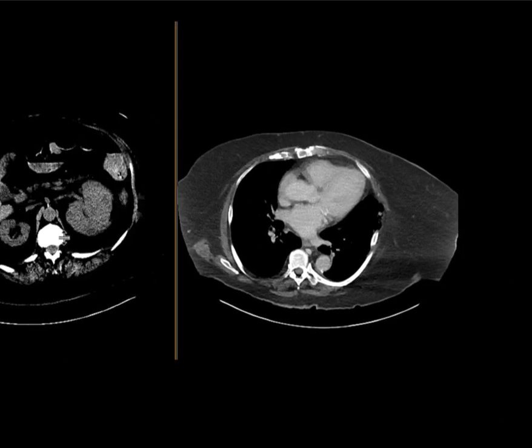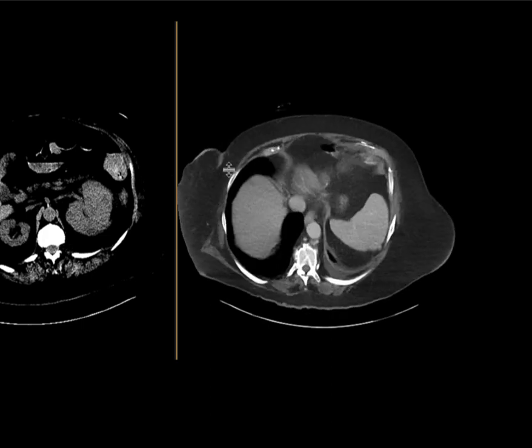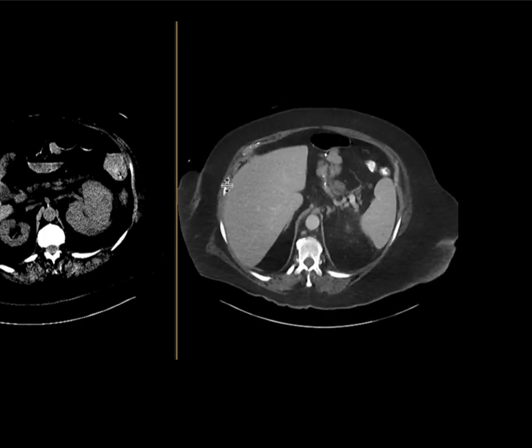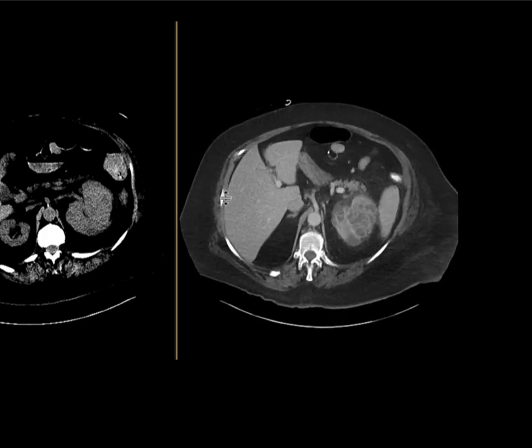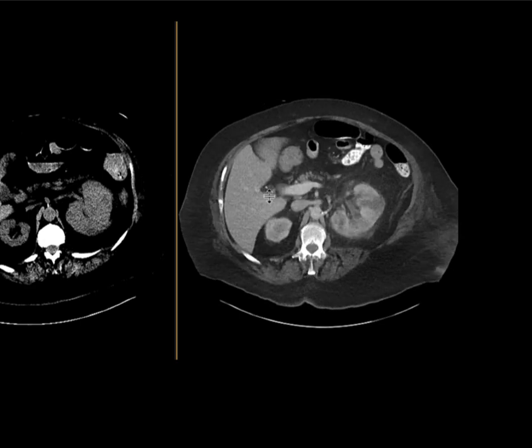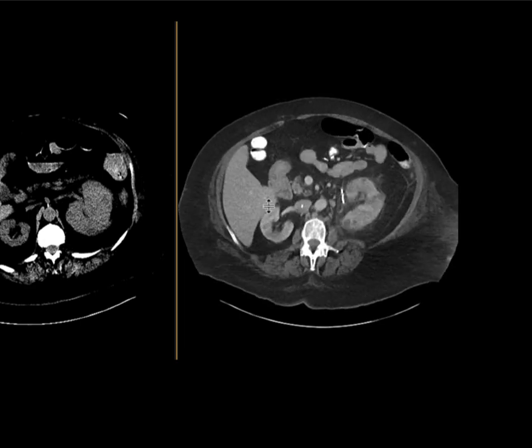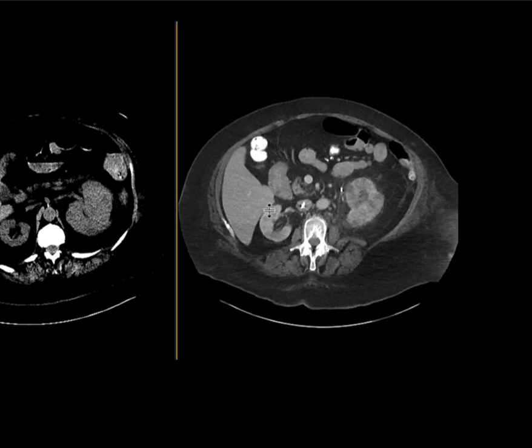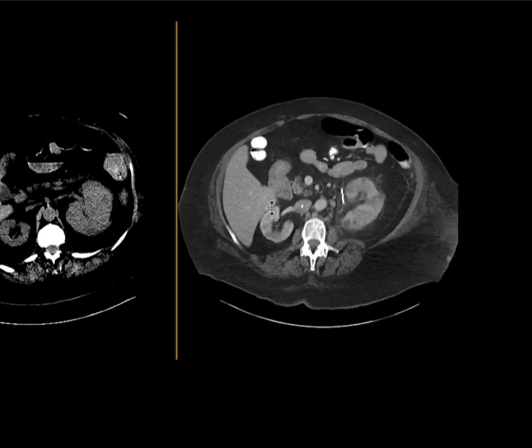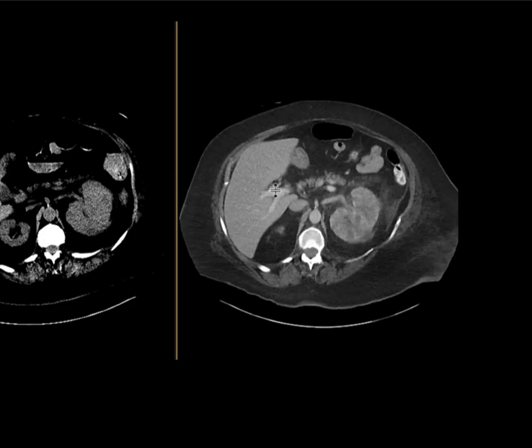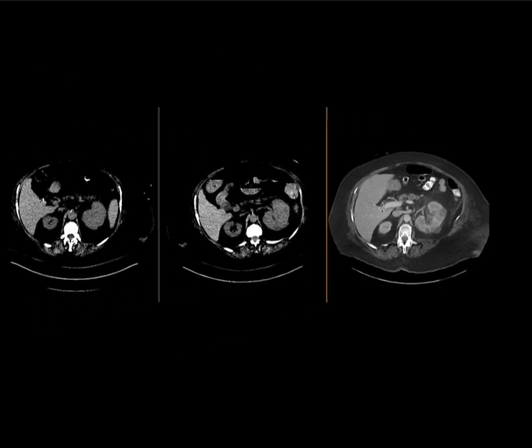A contrast-enhanced CT scan was suggested to further evaluate. On the contrast-enhanced CT done a little bit later, there are numerous abscesses and inflammatory collections associated with the left kidney, with abnormal enhancement of the parenchyma compatible with pyelonephritis.